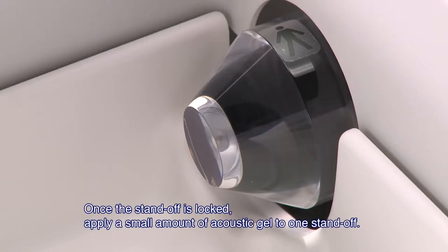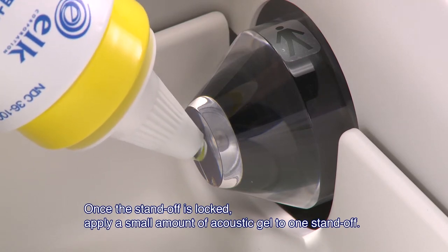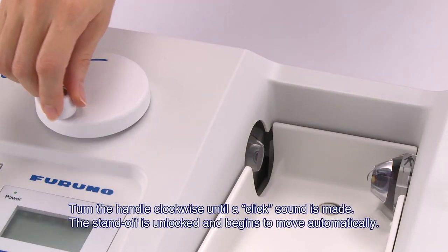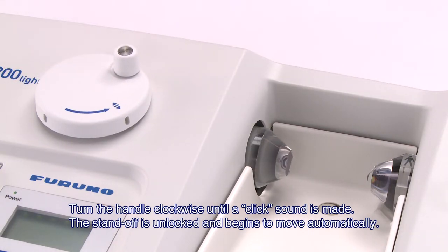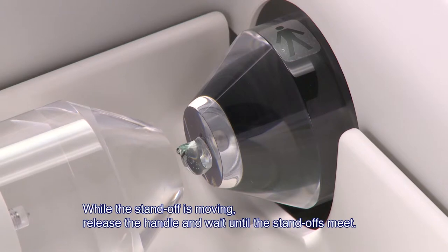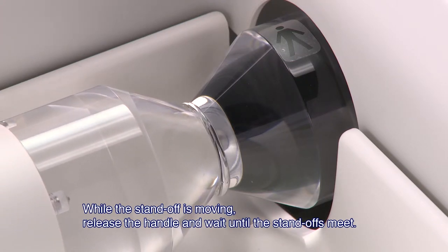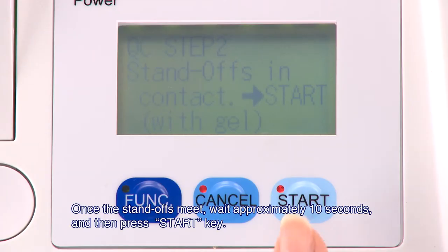Once the standoff is locked, apply a small amount of acoustic gel to one standoff. Turn the handle clockwise until a click sound is made. The standoff is unlocked and begins to move automatically. While the standoff is moving, release the handle and wait until the standoffs meet. Once the standoffs meet, wait approximately 10 seconds and then press the start key.